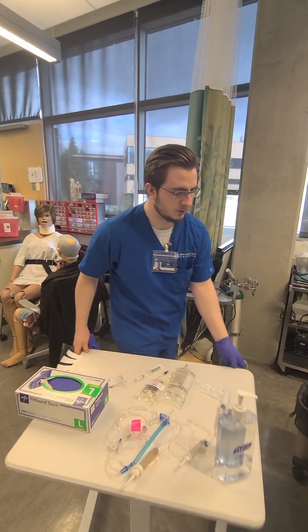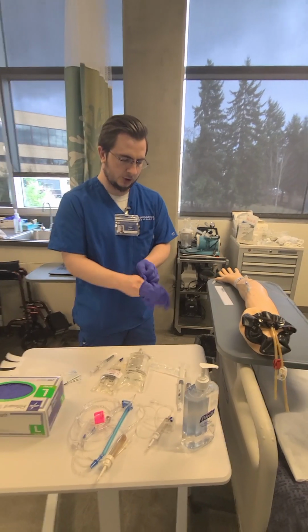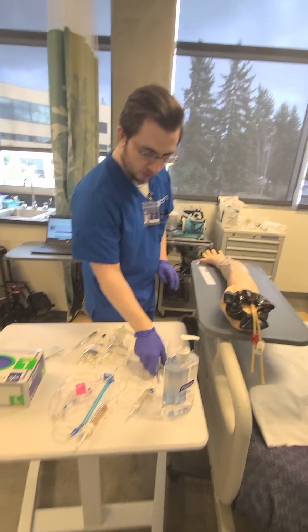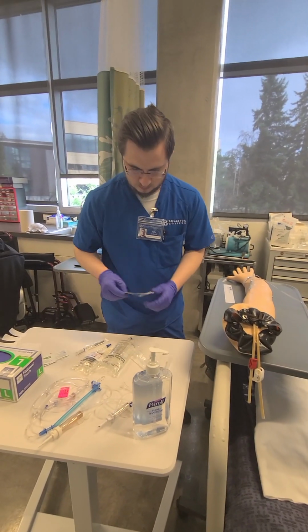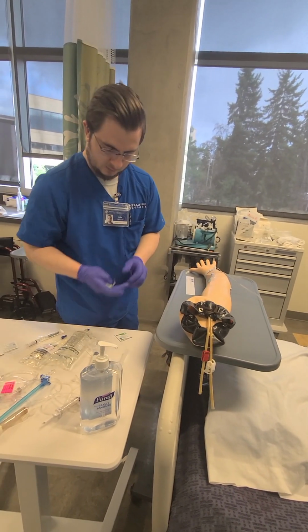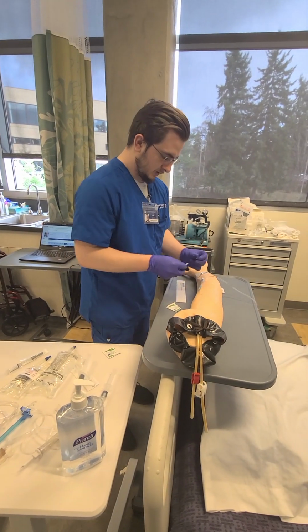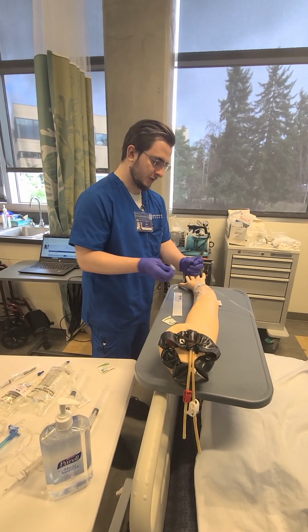So let's position this like so. I'm going to first flush your line real quick. I'm going to assess the line and the surrounding area just to make sure there's no edema, swelling, etc. Let's see this one. I do this for 30 seconds.